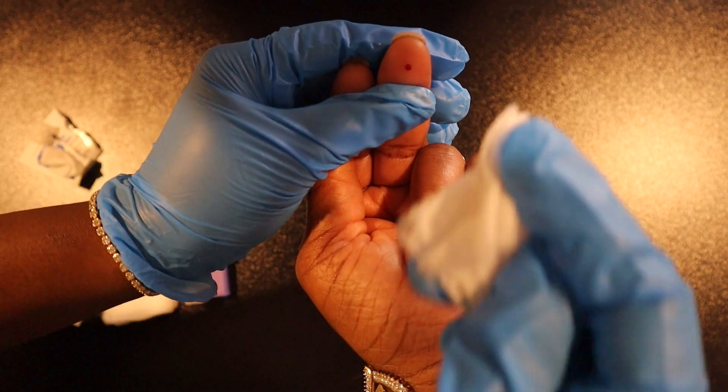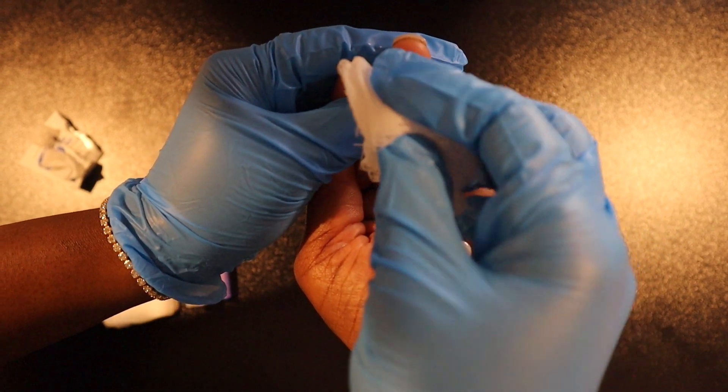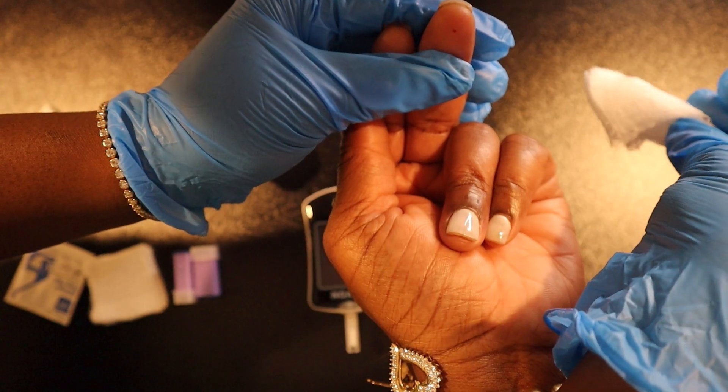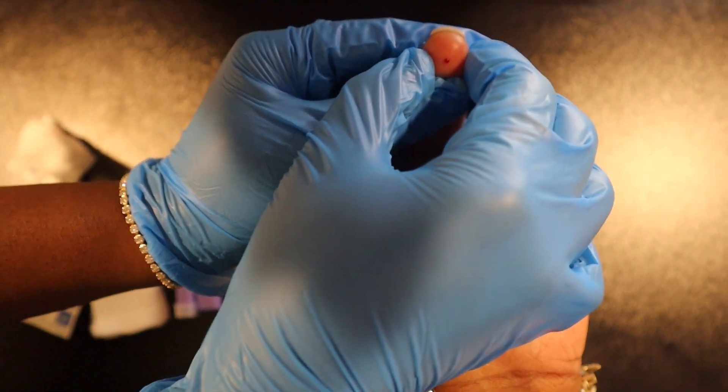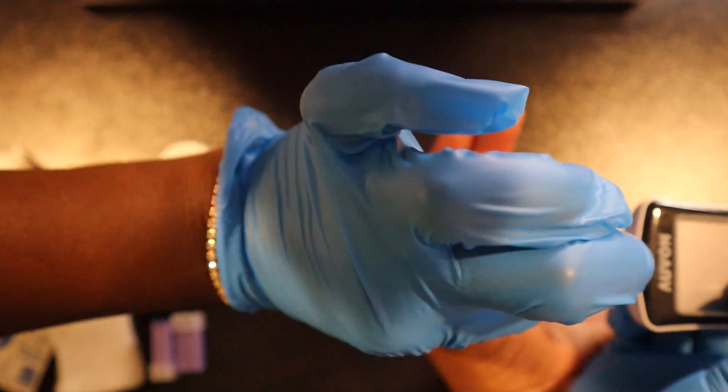We have our first drop of blood, and we're going to wipe away that first drop to avoid getting a false reading. If you have to, you can lightly stimulate the finger until a drop of blood has come out.